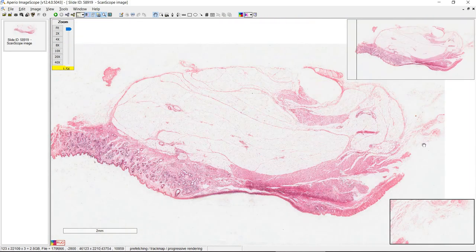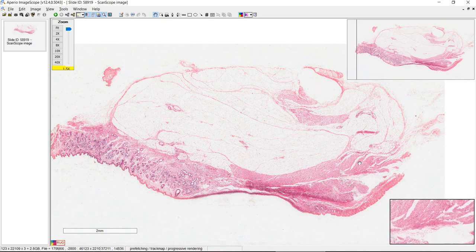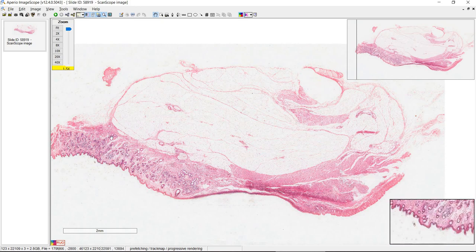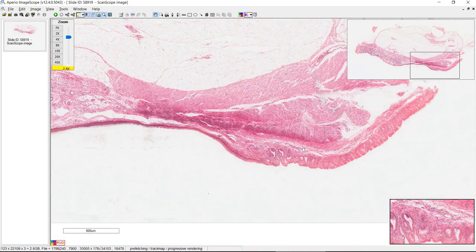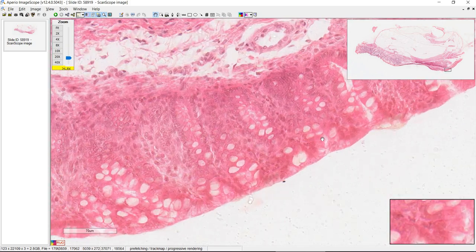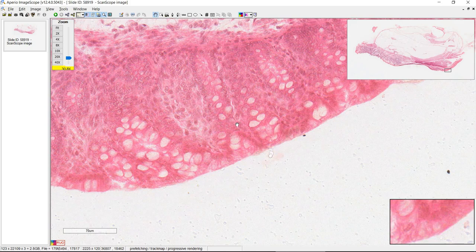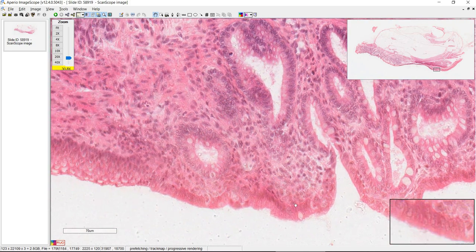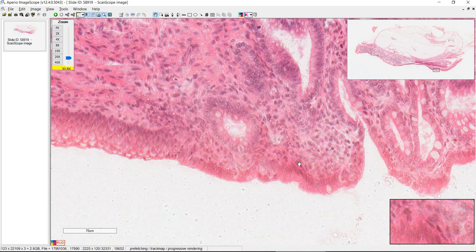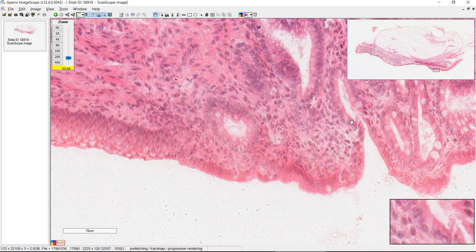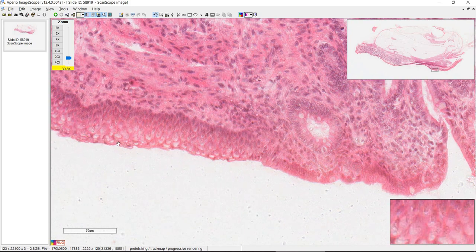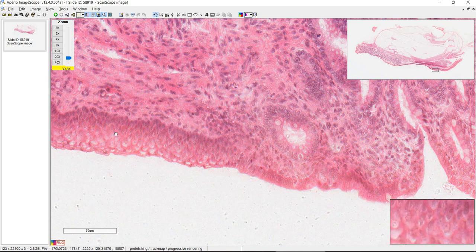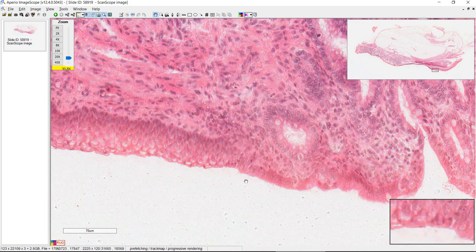Now let's move on to the anal canal — there's a lot going on in this slide, so I recommend you spend more time studying it. On the right side of the slide we have the rectum, or the end of the colon, and on the left we have the anus. Looking at the epithelium at higher power, we see enterocytes and goblet cells — simple columnar epithelium. As you move towards the anus, you can find the pectinate line, which is the abrupt transition from simple columnar epithelium to stratified squamous epithelium. This looks like stratified squamous, and this is simple columnar, so the pectinate line is somewhere around here.